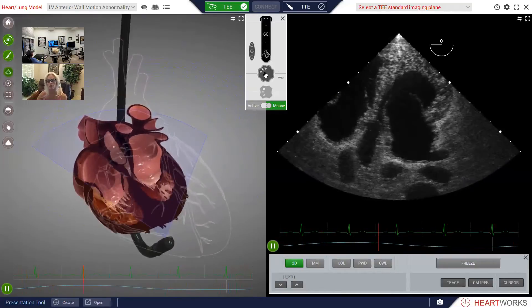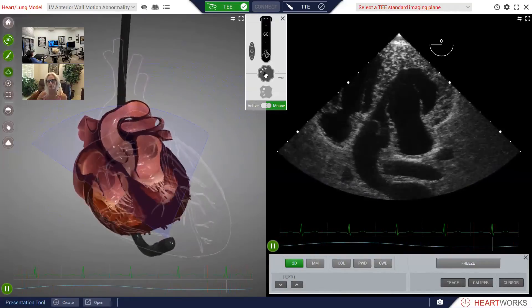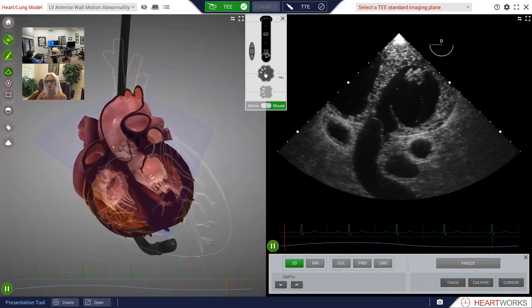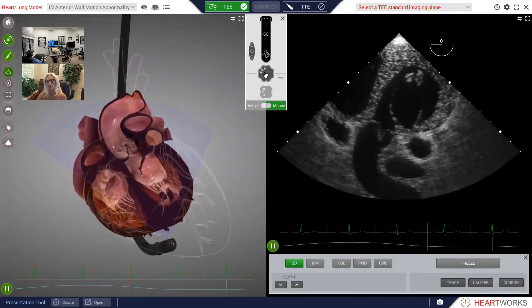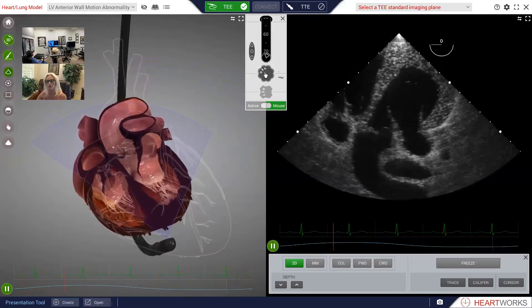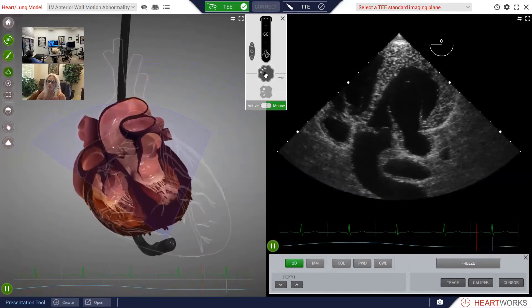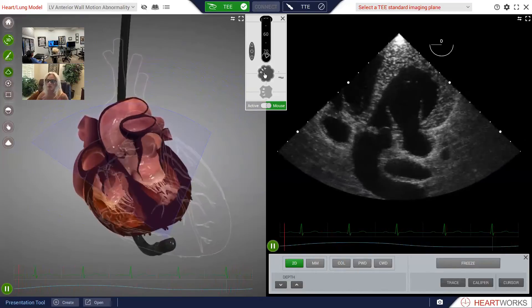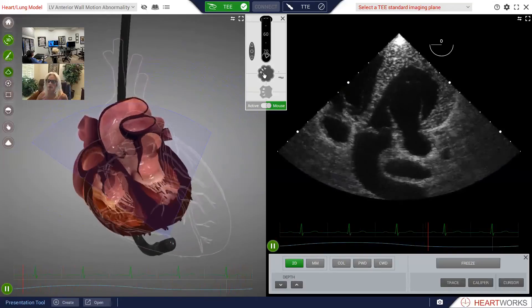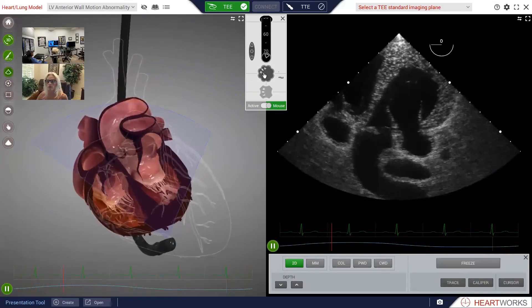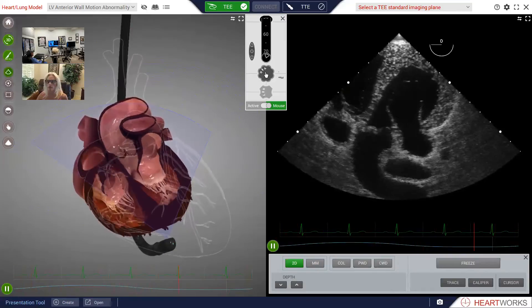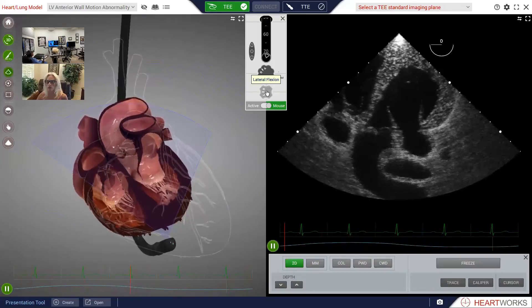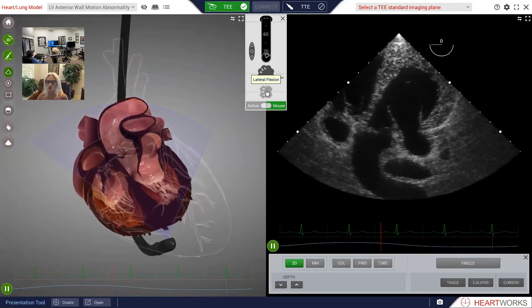Now let's back off so that we're in the tricuspid annulus. As we back up, we're actually going to be right there in the anterior tricuspid annulus. That might be a bit too much, so let's add in a little bit more anteflexion — that should be good, right about there. Now we're in an imaging plane where we see the aortic valve in center screen and the ascending aorta in arch. That means the imaging plane is not where we want it, which is in the pulmonary RVOT outflow tract — it's actually posterior to where we'd like to end up.